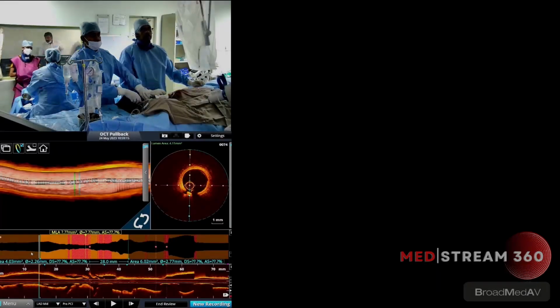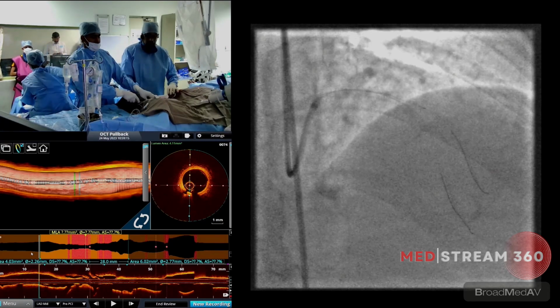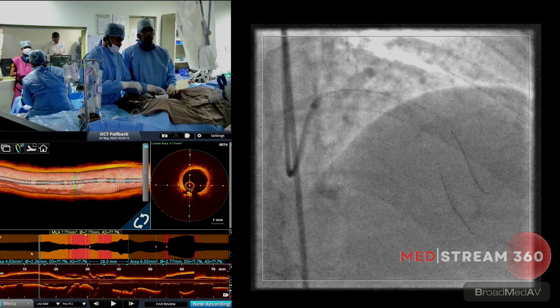There is some compromise of the flow. Anyway, I think we'll do the pot. After that, we'll decide what to do to recross. We'll take one image in LAO caudal and see what. Okay, let's take an LAO caudal.